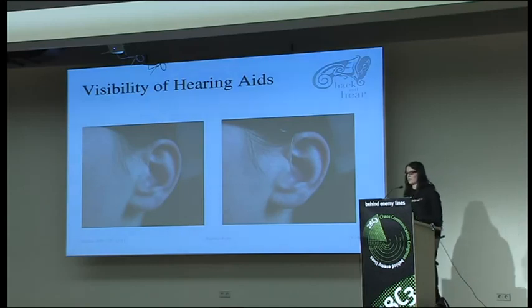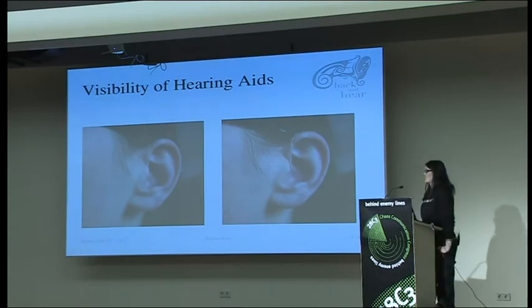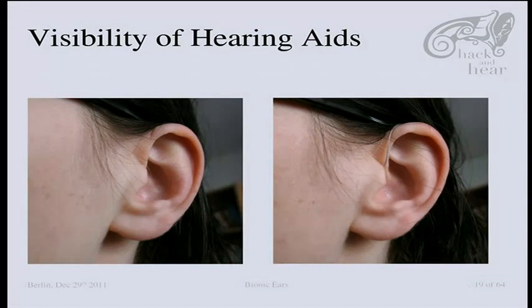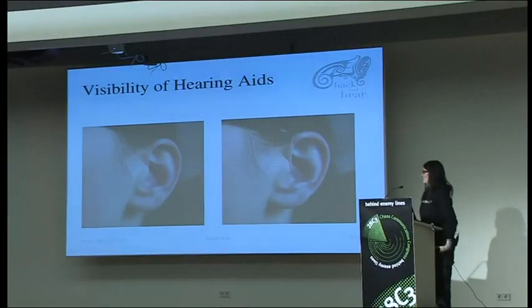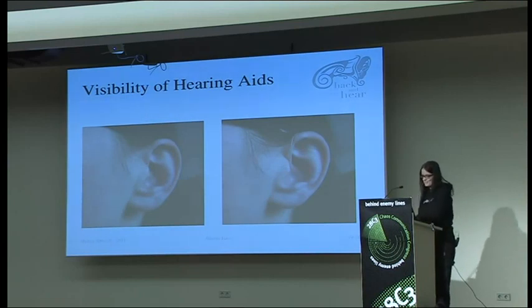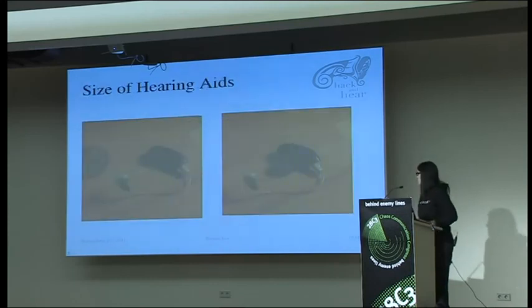Hearing aids got pretty invisible. These are pictures of me wearing my hearing aid and not wearing it, so except for this little wire on the right side, you cannot really see it. Most people that don't have hearing aids find this an advantage. People who have a hearing aid actually are not that sure about it, because sometimes when you have to ask someone to repeat a sentence, if they know you're wearing hearing aids, they think, okay, she didn't get it because of the acoustics. And if they don't see it, they think, yeah, she didn't get it because she was stupid. So it's really not that obvious, and sometimes it just helps that people see that you have a handicap.